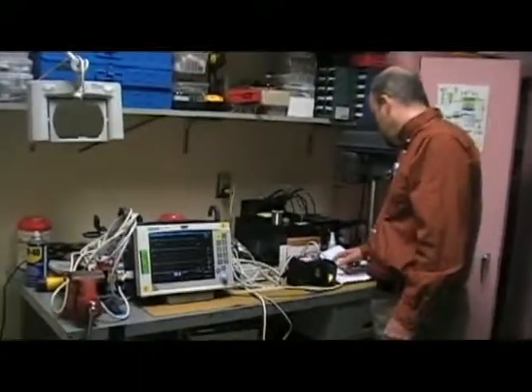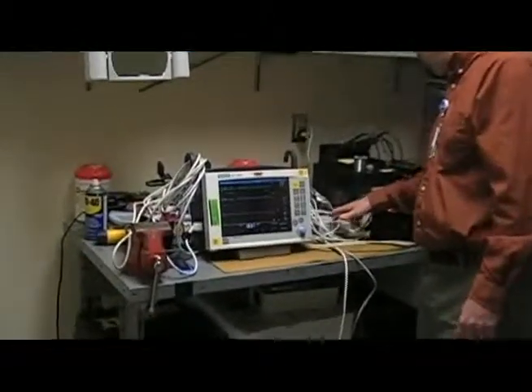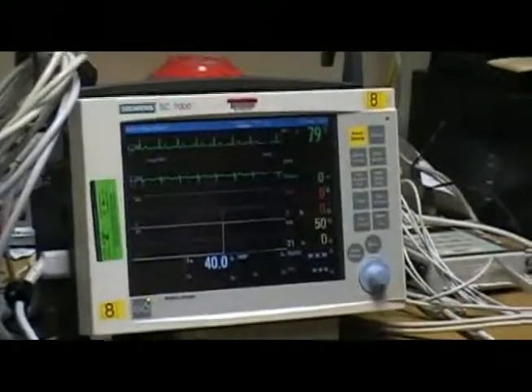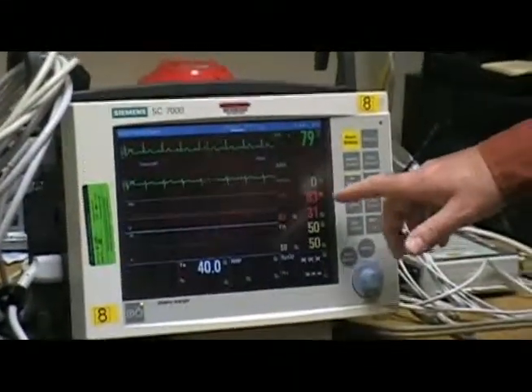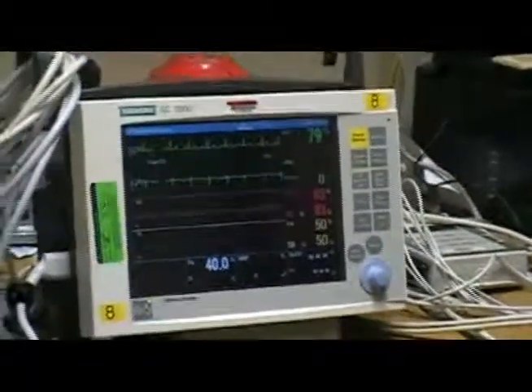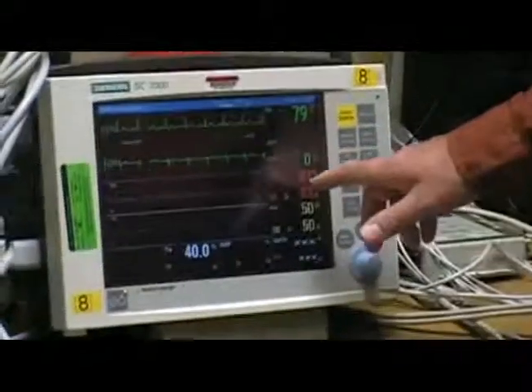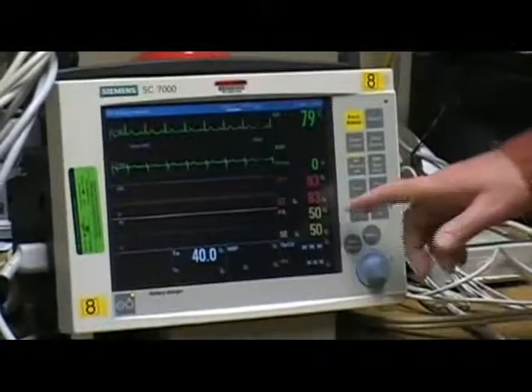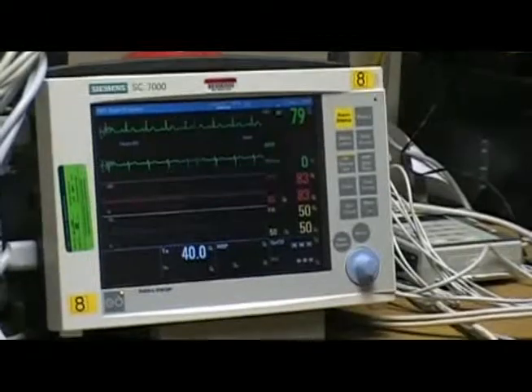And then we would go to number 9 on the simulator. And that'll give us our arterial pressure of 80. It sets it for 80, and the PA pressure should be 50. The limit for the arterial pressure is plus or minus 5 millimeters of mercury, and so is the PA pressure, so we're within limits on those two.